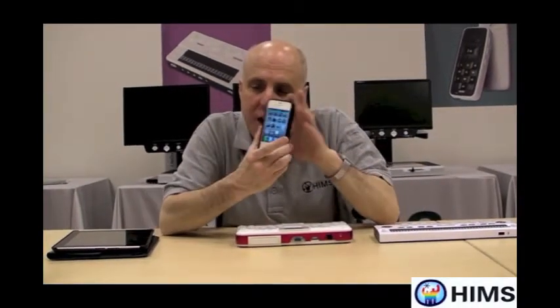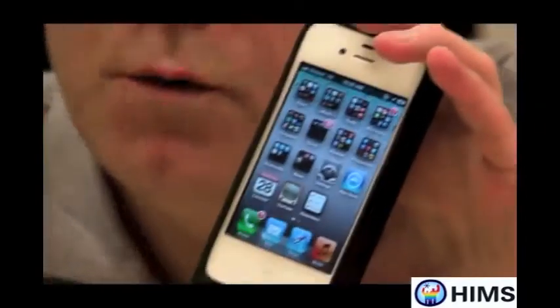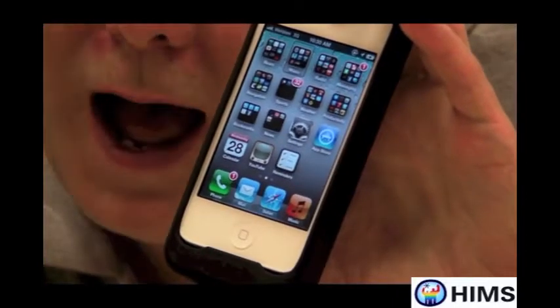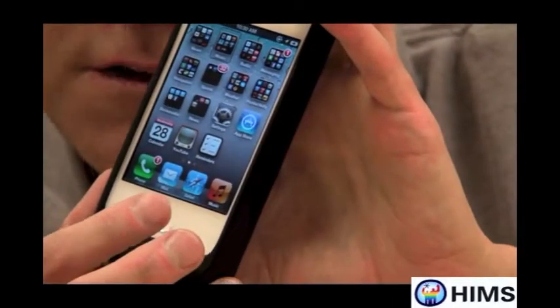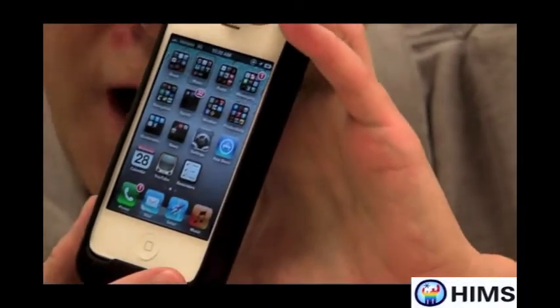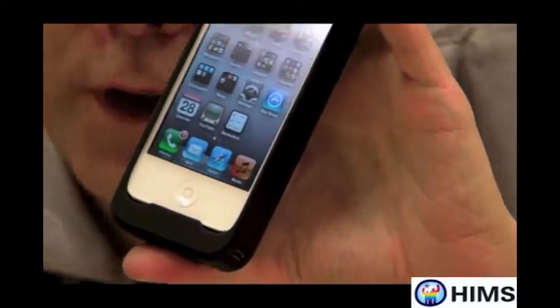I'm going to place this back on the table and use my iPhone to connect it with the U2. The first thing I need to do is find Settings. But before I do that, let me remind you that you want to make sure VoiceOver is turned on on your iPhone. To do that, you simply press three times the Home button on the bottom of your iPhone. VoiceOver is now fully working.